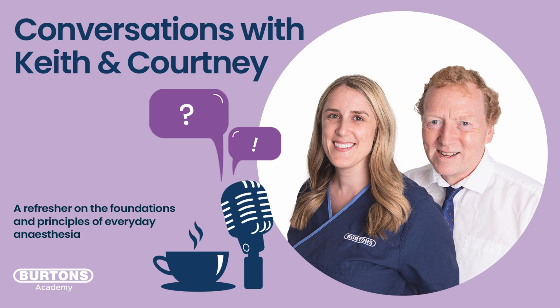So one of the last things maybe to talk about is the influence or hidden things that might happen with pulse ox. We talked about methemoglobin a bit last time and carboxyhemoglobin. So carbon monoxide poisoning and what it would do to a pulse ox. It doesn't actually change the saturation value. You could have quite a lot of carboxyhemoglobin, but you'd still get normal saturation levels.